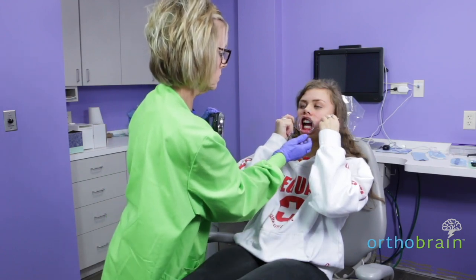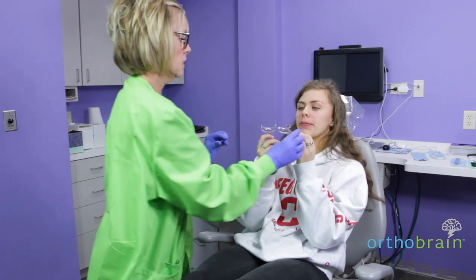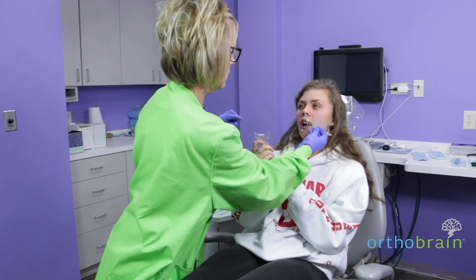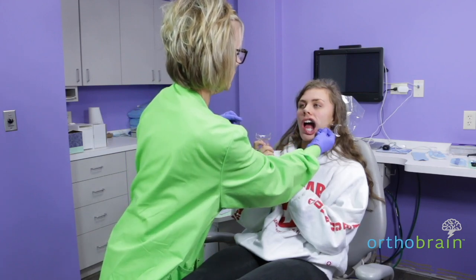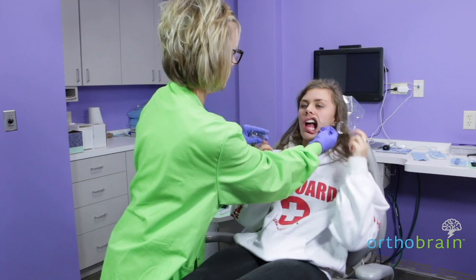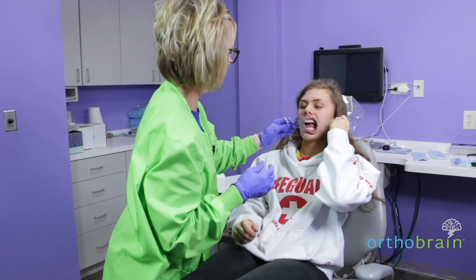Let's take those out. I want to put the larger end on one side, which is the side that we're not going to be taking the picture of. And then we're going to put the smaller end on the photo side.